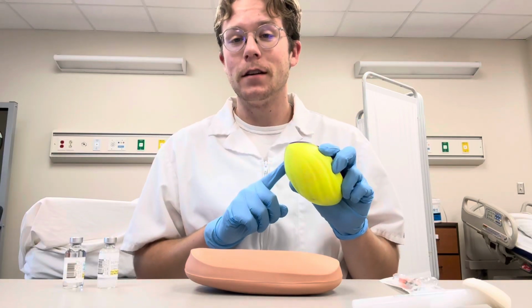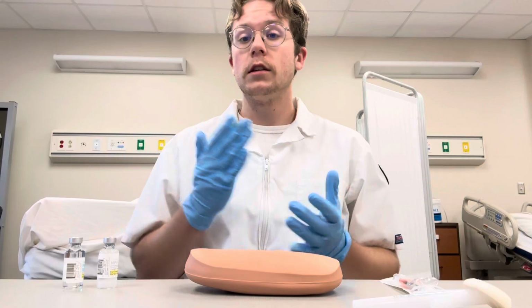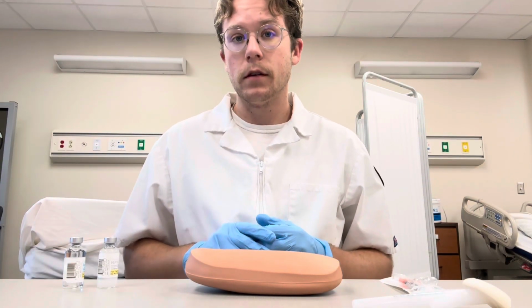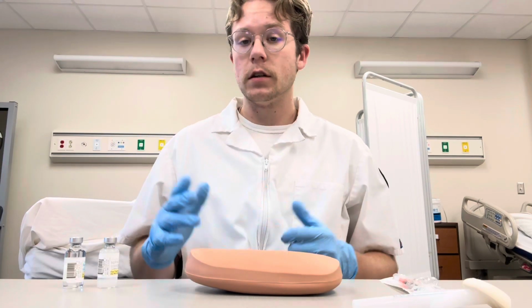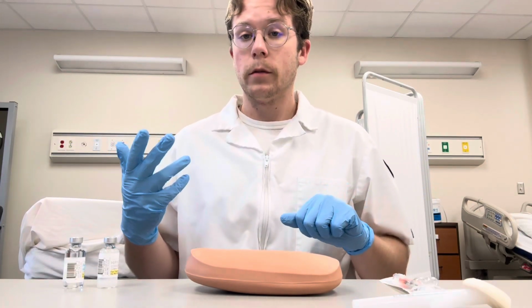So our blood glucose level was 252, which is a little high. So we will continue with insulin administration now. We'll look at our orders in the MAR and compare them with our findings and identify our patient. We performed our hand hygiene and donned our clean gloves. And then we'll perform our focused assessment.